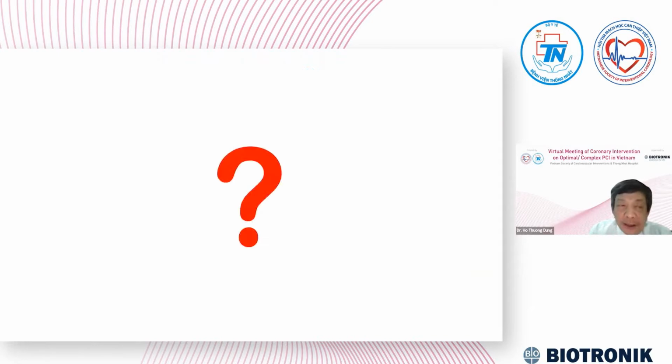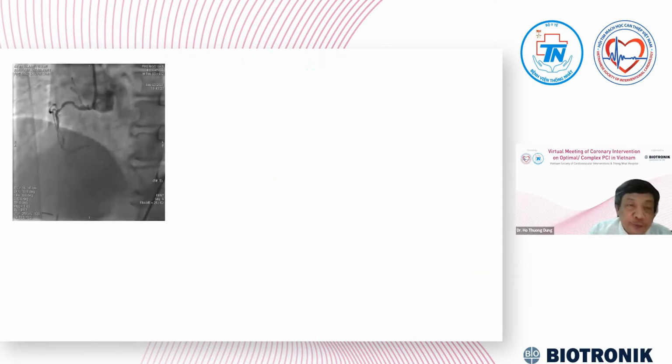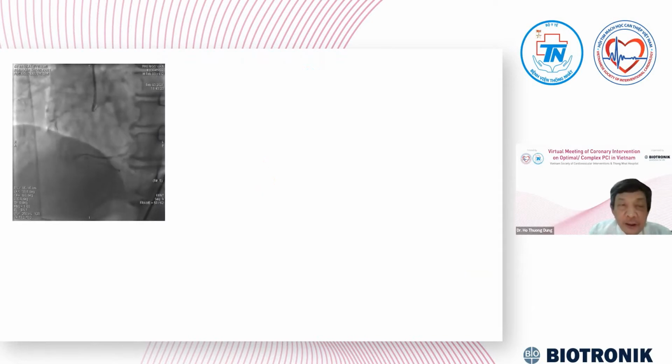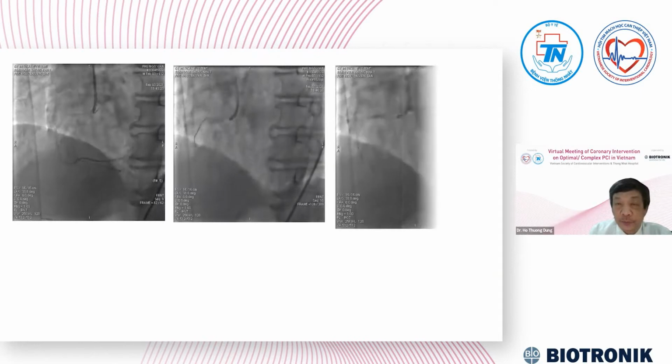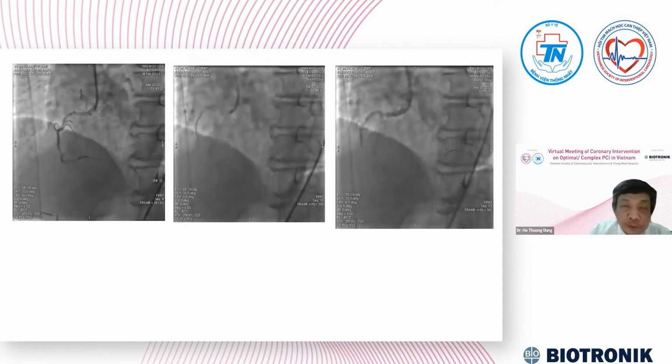And first we are wiring, a little bit difficult, and pre-dilatation.